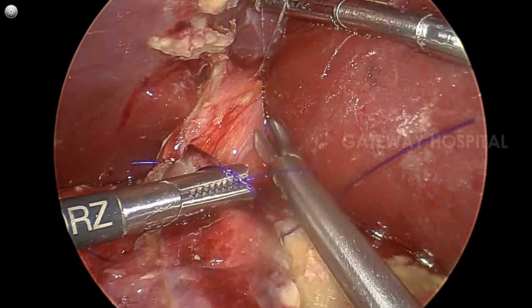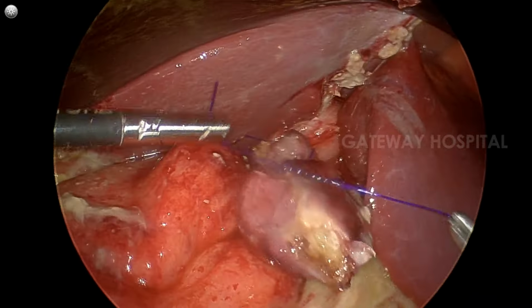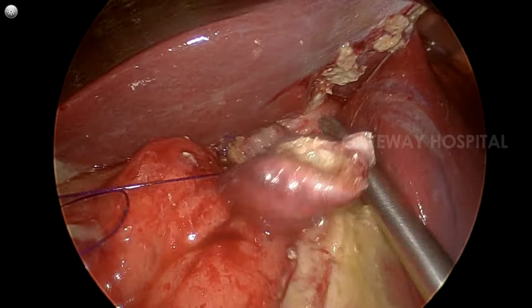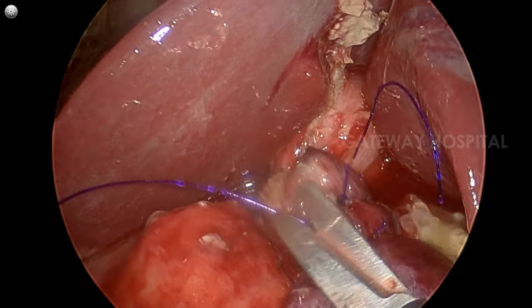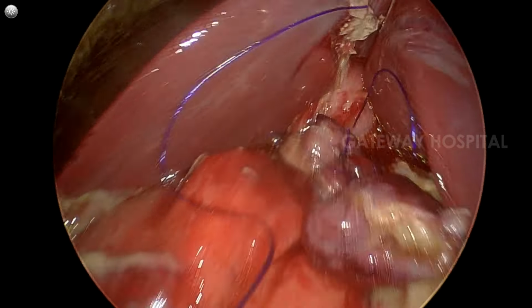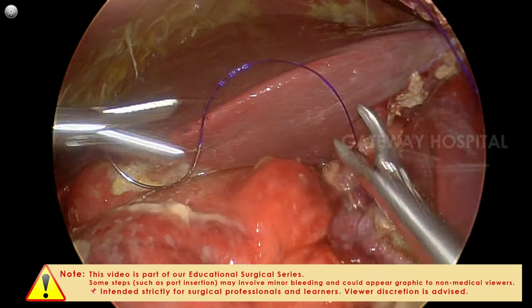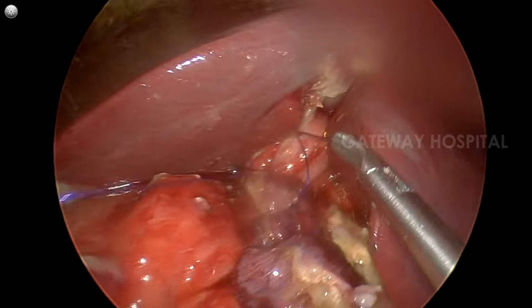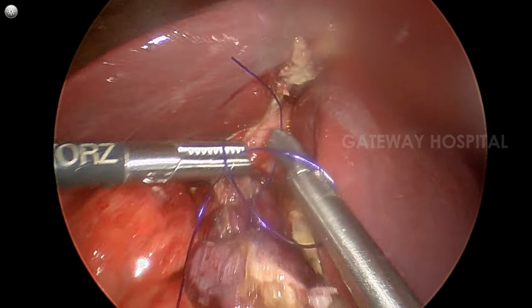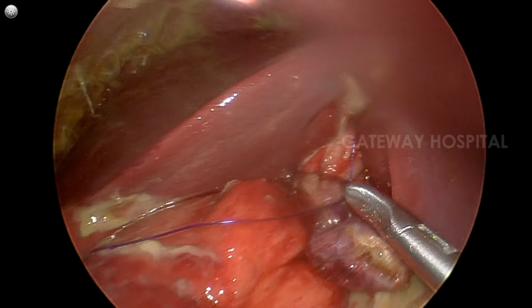Normally people close the perforation and then keep the omental patch or falciform patch over the suture area. But here we always take sutures and keep the falciform or omentum over the suture and over the perforation, and we tie it around the perforation. We put another 1 or 2 additional stitches in order to secure the closure, and the closure is almost done.